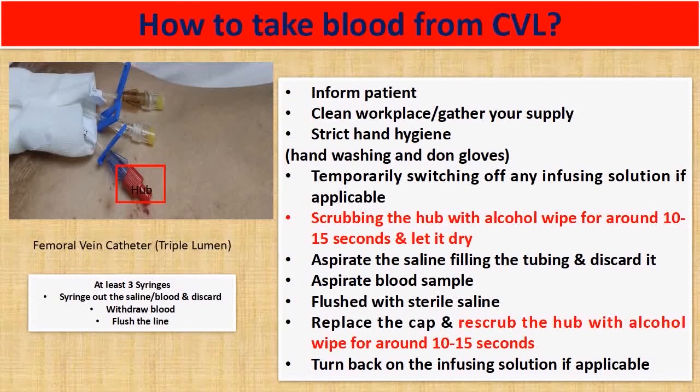Then you will have to scrub the hub again with an alcohol wipe for another 10 to 15 seconds. Lastly, and also the most important step, if you have turned off any infusions before that, please make sure that you turn the infusion solutions back on at the end.